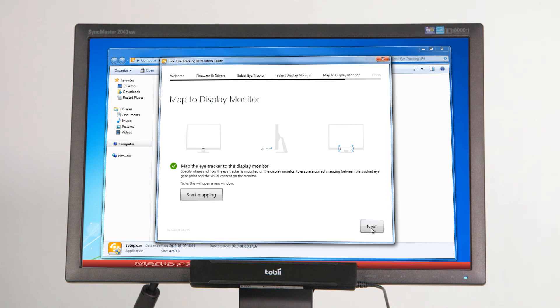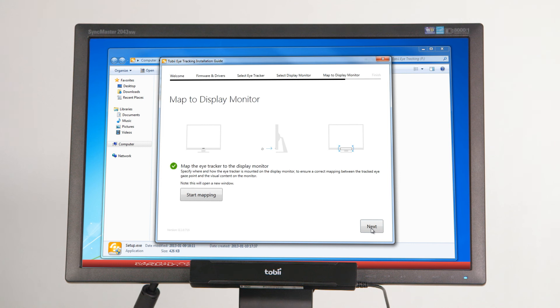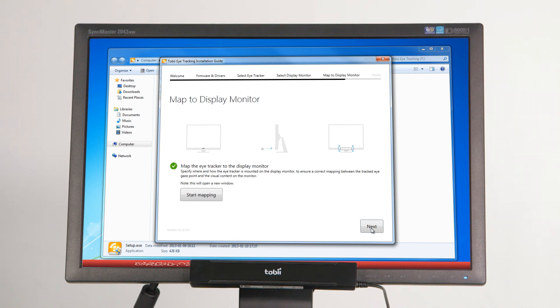In the fifth step of the installation process, you will configure where the eye tracker is positioned in relation to the active display area of the screen. It is very important that this step is performed with utmost care, as a wrongly made configuration can result in offsets in the eye tracking data. Click the Start Mapping button to begin the configuration.